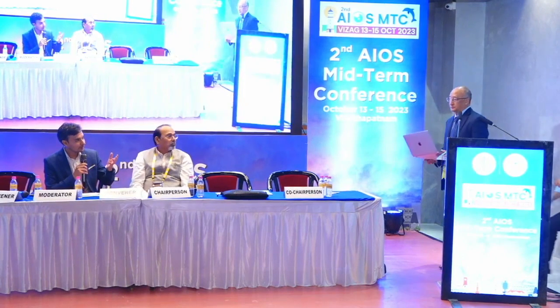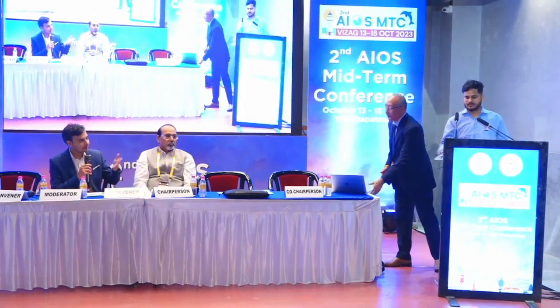When it comes to the use of femtosecond laser technology, sir, have you done any study comparing manual versus femtosecond laser for posterior polar cataracts? Yeah, we published this, I think, 6-7 years back, and in that we compared manual with femtosecond in 100 cases. There were 40 femtosecond cases, and in both ways we didn't have a significant difference in terms of complications. That's mainly because it was an experienced surgeon doing the surgery, and we understand how to manage these cases.